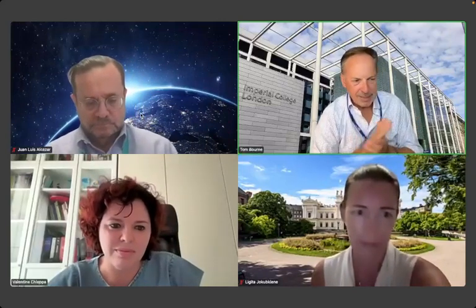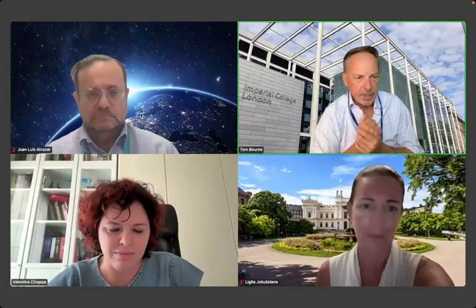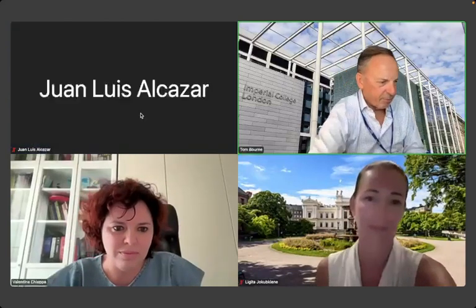But she's an expert in the evaluation of patients with gynecological cancer. So quite a big topic we have for you, but we're going to talk about applications of ultrasounds in gynecological oncology, and then hopefully we're going to have some interesting questions, Valentina, so don't go away. I'll hand over to you.